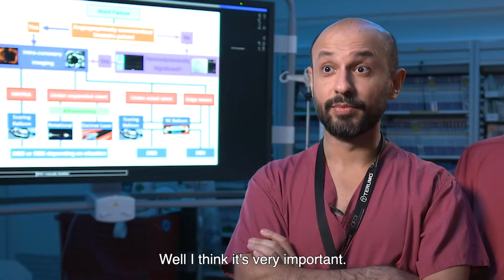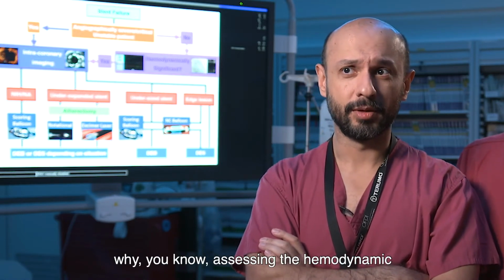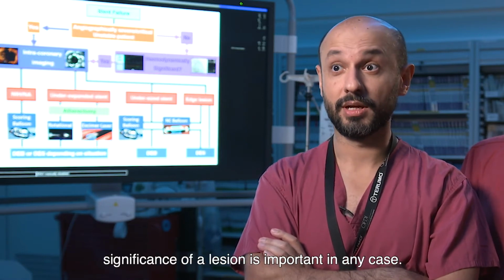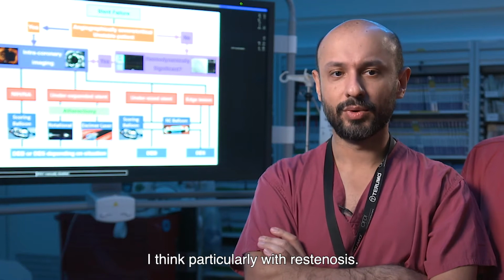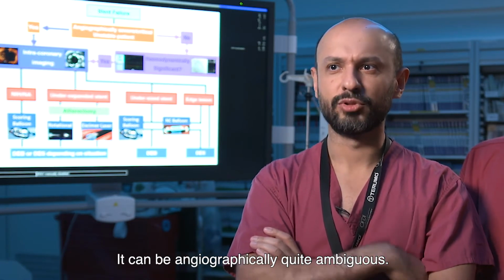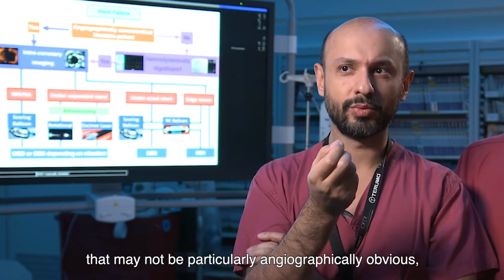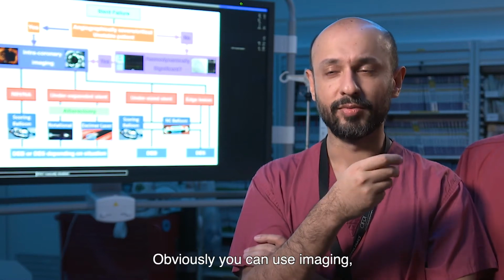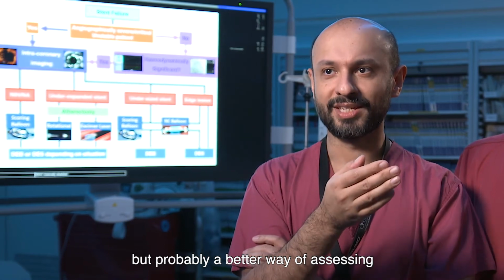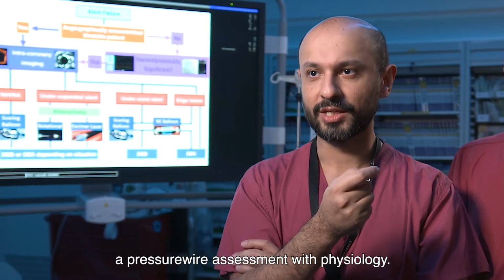I think it's very important, and essentially similar to why assessing the hemodynamic significance of a lesion is important in any case. Particularly with restenosis, it can be angiographically quite ambiguous. So you may have a hazy appearance. It may not be particularly angiographically obvious whether it's flow limiting or not. Obviously, you can use imaging, but probably a better way of assessing whether the lesion is ischemic is to do a pressure wire assessment with physiology.